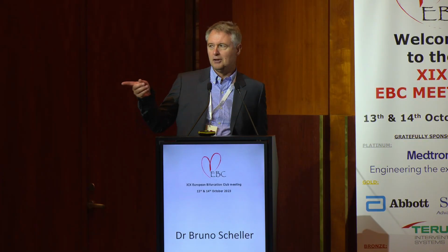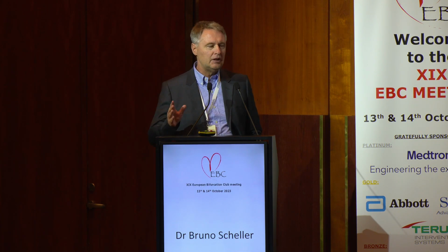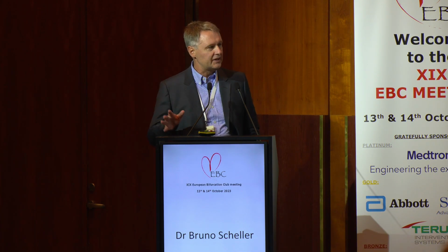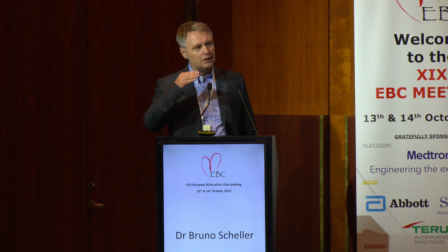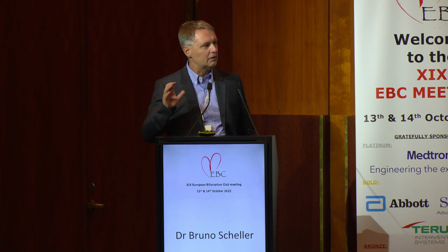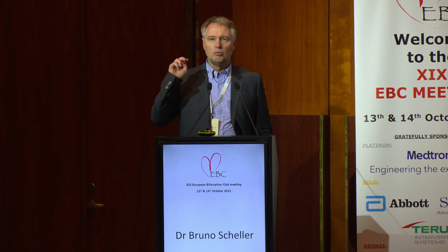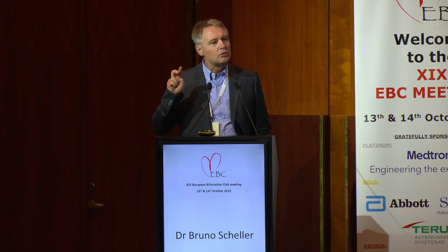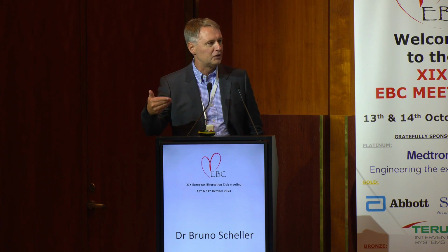Is there anything? Yeah, very important point. I disagree a little bit with Simon with respect to left main. If you have ostial left main disease, you need a stent, in my opinion, because aorto-ostial disease requires stenting. We can start talking about DCB distal from the ostium of the left main. For distal left main, it's fine, but if you have ostial left main disease, you need stenting. If you go more downstream, then there is no real need for stenting if you have an acceptable pre-dilatation result.